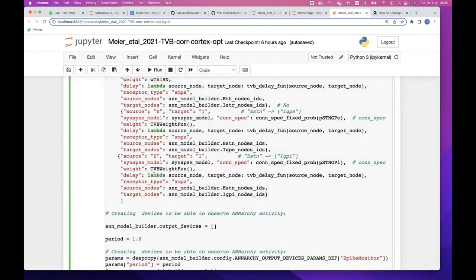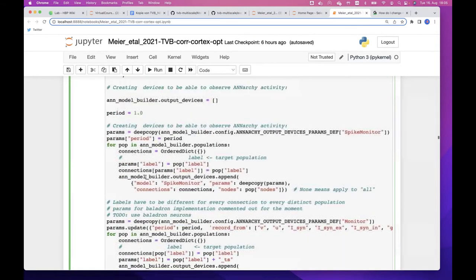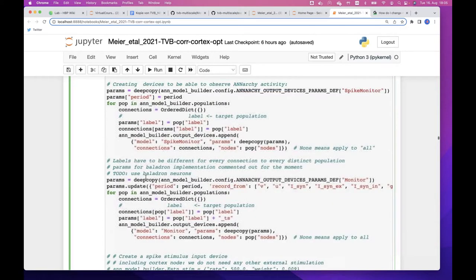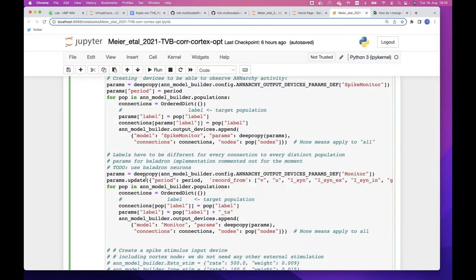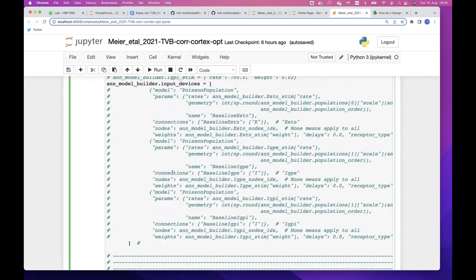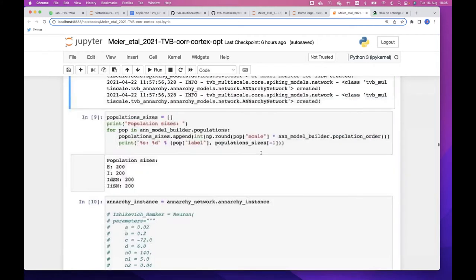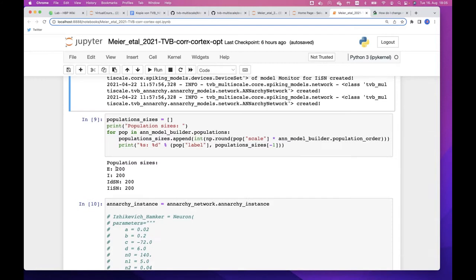And we, as you have seen with the arrows of this network, have quite a lot. So I will skip some part that will be setting connections. Connections, connections, lots of connections that you define singularly, and which gives you lots of creativity, let's say, to change the spiking network here inside the multiscale as well. It doesn't come all the way from the outside and needs to be fixed, but you can also adjust it later.